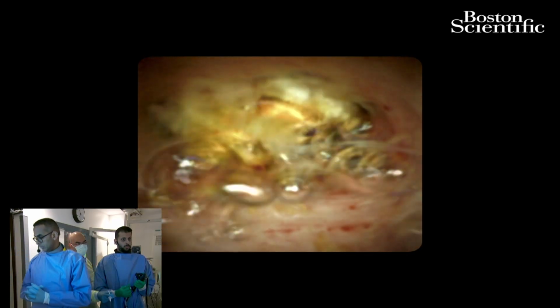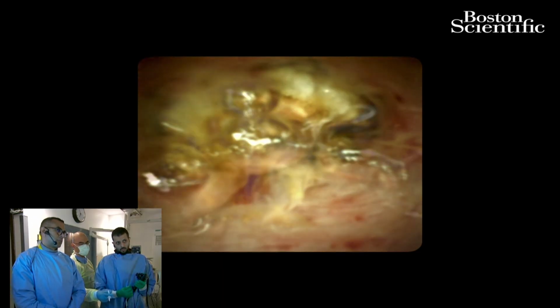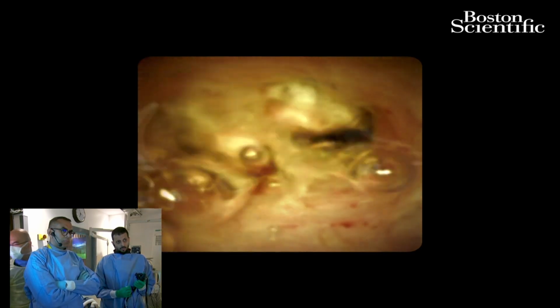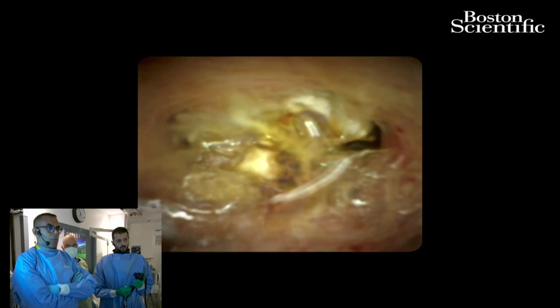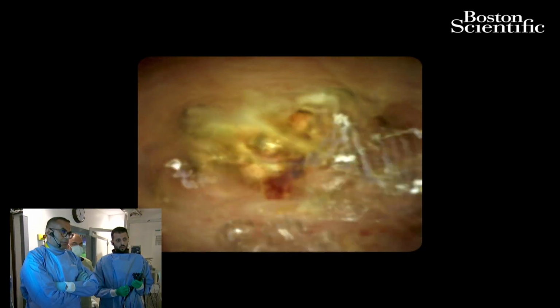So Saad, Ahmad, when you have a stricture, do you do the three things? Do you do brushing, some bile for cytology, and biopsy, or do you just go for biopsy only of the abnormal area? Is the yield of three better than the yield of one?